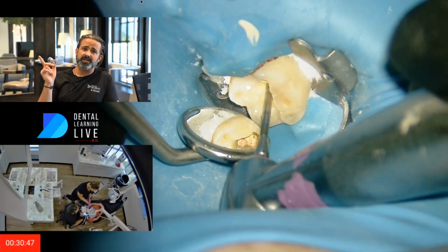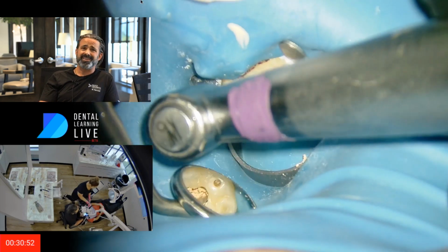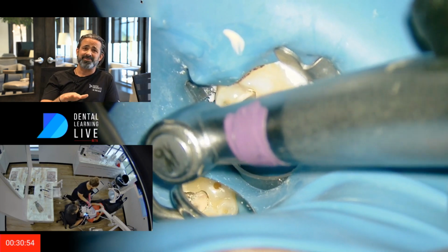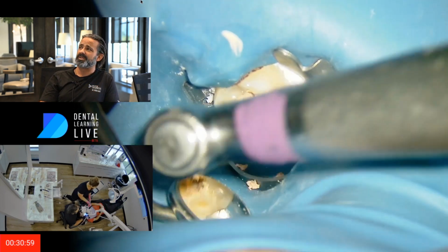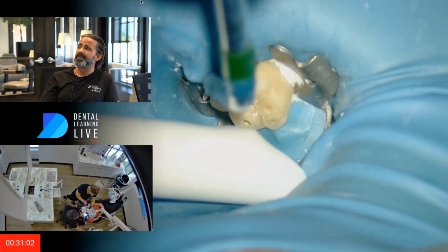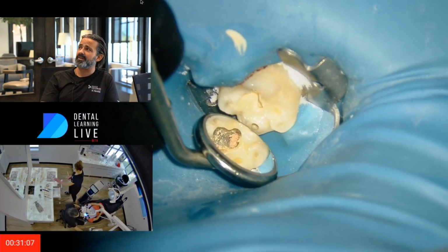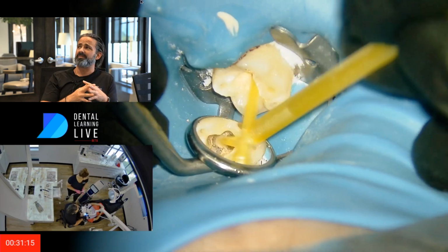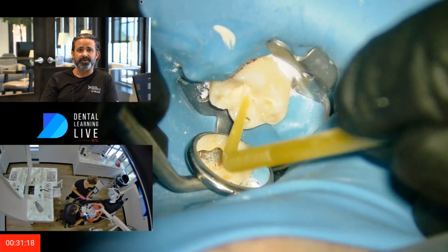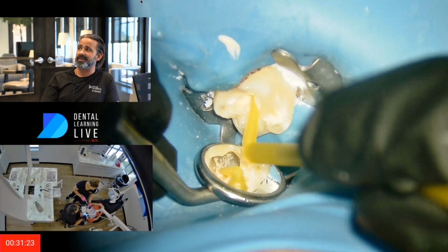And what I used here is, I don't know if you guys have ever done this, but this is just a parapost drill. I really like them because I'm not countersinking it, I'm not going in the canal with it, but I like actually using that on top of gutta percha. It just really pulls the gutta percha up. It was intended, the burr was designed to remove gutta percha, like in a post space scenario. Works really well because it is end cutting, and it doesn't really gouge your walls out. If you are accessing with a high-speed burr, you can just gouge it out. So just a trick, just a little endo hack, I guess.